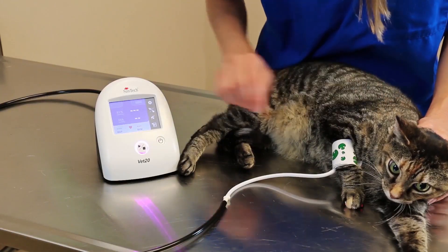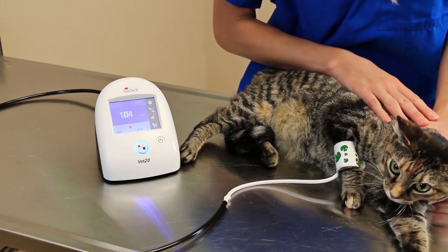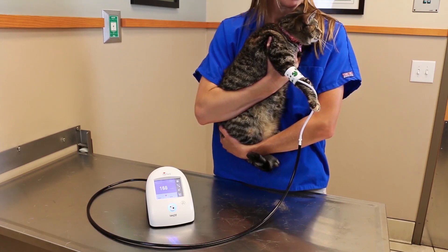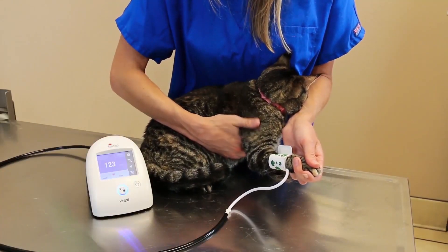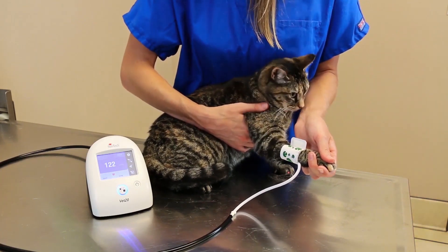If the patient is lying on the table, place one hand on the patient and press the start button. If the patient prefers to be held, you may do so while taking the blood pressure measurement. You may also take the BP measurement while the patient is sitting upright, as long as you support the forelimb.